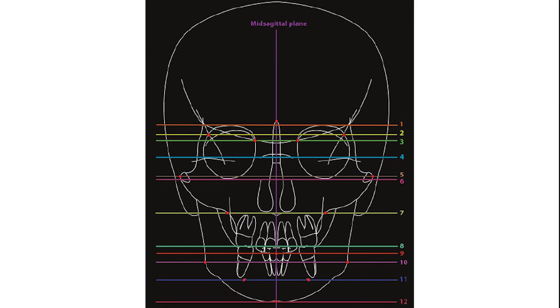Now we are going to look over the hard tissue posterior anterior cephalometric reference planes based on the hard tissue posterior anterior cephalometric landmarks discussed in the former lecture. First is the vertical reference plane, the mid-sagittal plane. It is a vertical line drawn through crista galli and nasion, parallel to a true vertical line. It should pass through ANS, between the central incisor teeth, and through menton.